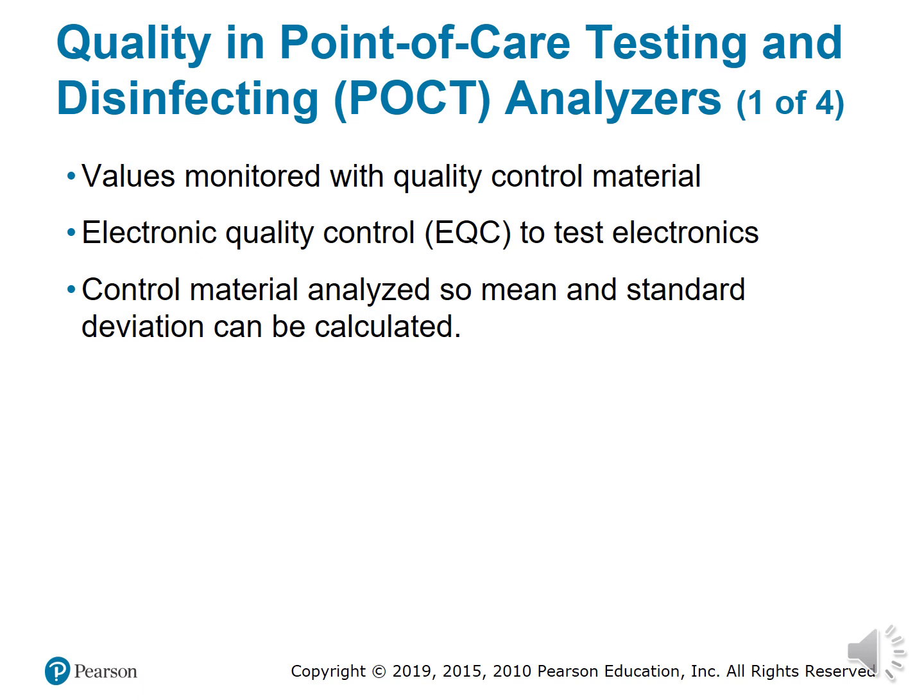It's kind of a bulky instrument, but it's still considered point of care testing because it gives you a result right then and there. You don't have to walk it all the way down to the lab to get the results. So some of these bigger machines have their own quality control testing. You just have to hit a button and it'll do a quality control on its own.